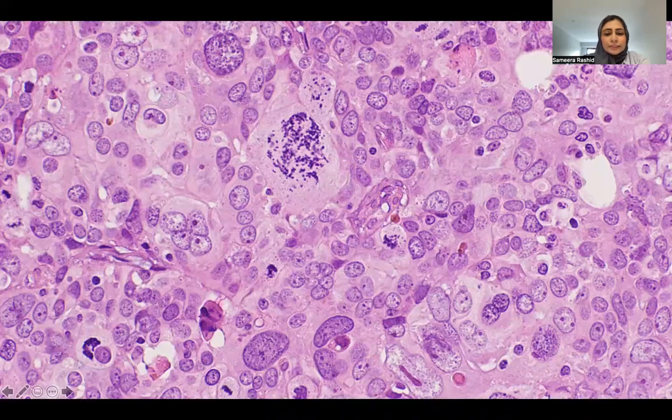This is what a classical case of high-grade serous carcinoma looks like. In the middle, I have this huge, bizarre mitosis, definitely atypical. There is a huge variation in size of the nuclei. Compare this one to this one, and this cell looks like it has 4 nuclei.